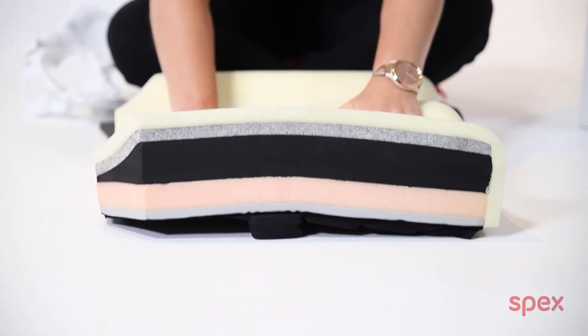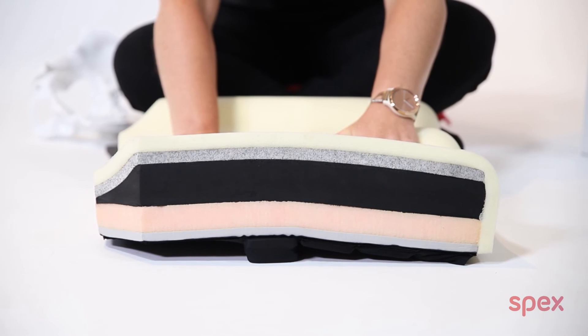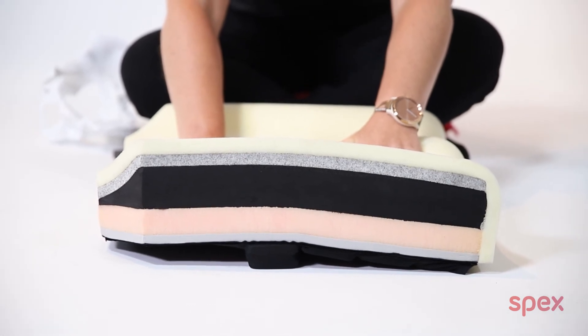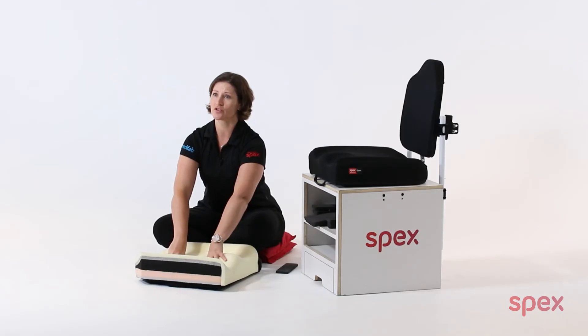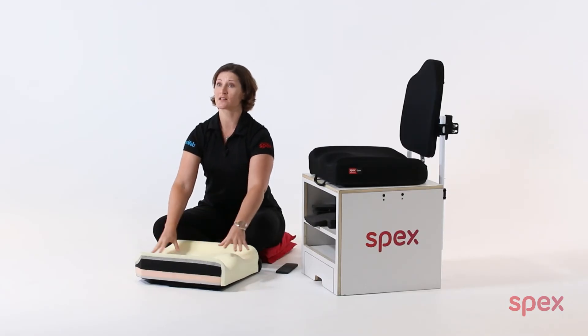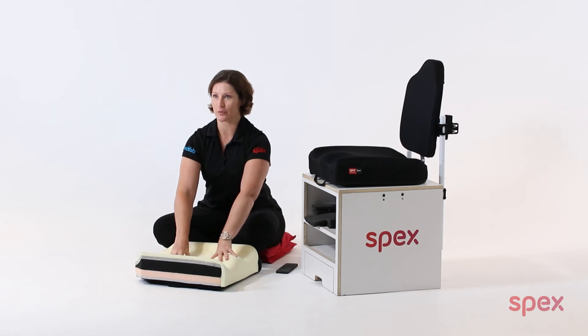When the wheelchair user is seated on the cushion, this additional block helps the ITs to remain in the ischial well. This optimizes pressure distribution, a more neutral and corrected pelvic alignment, and a more stable base of support.